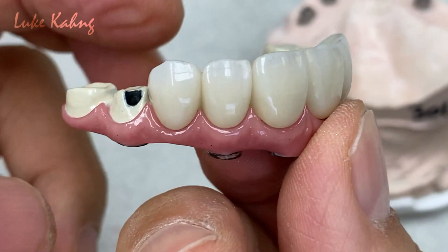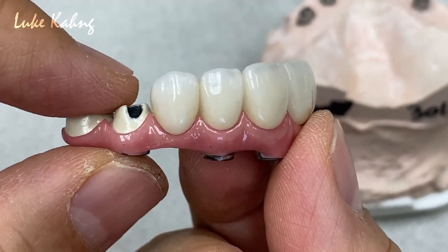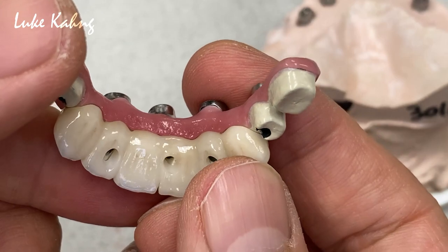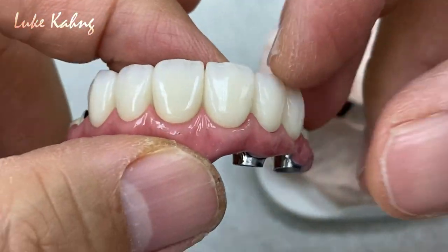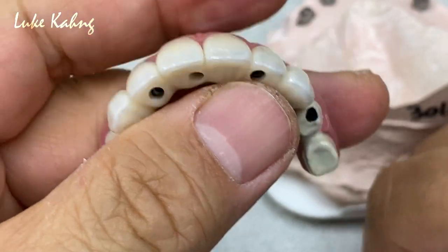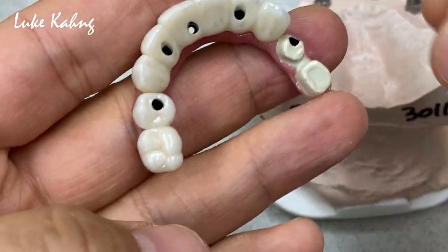This is another tough one. We just finished it because it's an extremely low vertical dimension. Therefore, we made the metal underneath. And also, this is a monolithic 6-unit bridge. This is a tiny one. Okay, this is what it looked like. And then another two monos, and then two monos together.